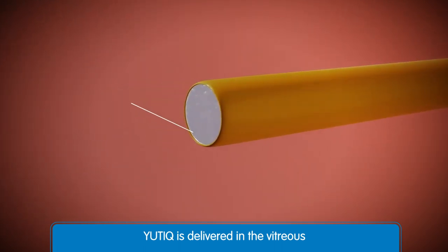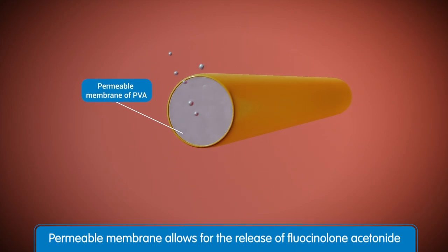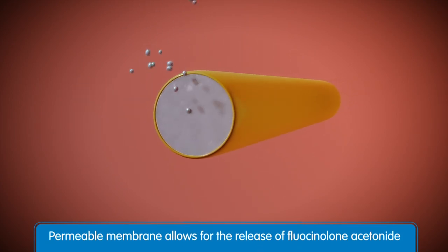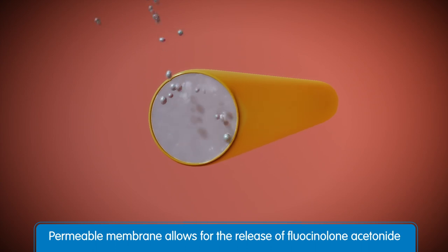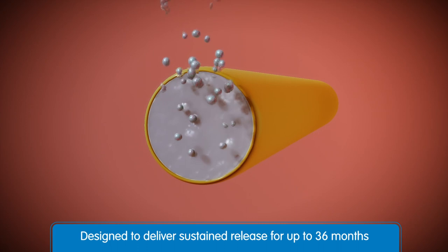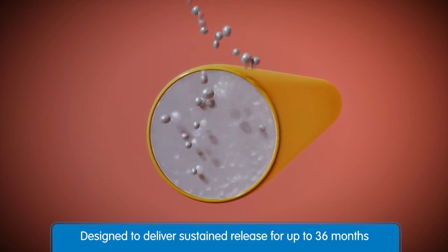One end of the implant is a permeable membrane made of polyvinyl alcohol where Fluicinolone Acetonide gets released. Because of the continuous micro-delivery of Duracert, Utique is designed to deliver a sustained release of Fluicinolone Acetonide for up to 36 months with just one implant.